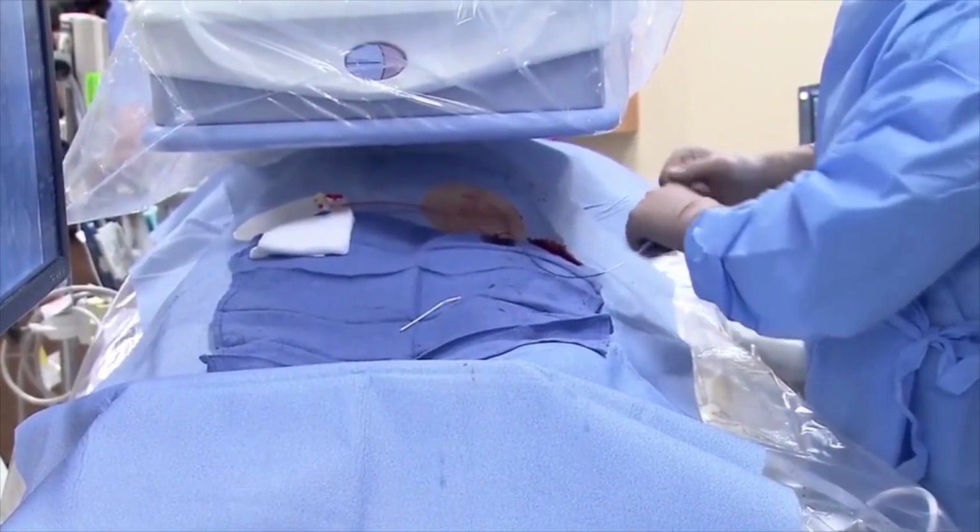And as Dr. Tonkin is injecting, on the screen what you will see is the contrast come into the vessel and opacify the distal aorta and both iliacs. And just kind of a look to see where the anatomy is, laying out the lay of the land and preparing to go over and treat the symptomatic leg. Right. Excellent.